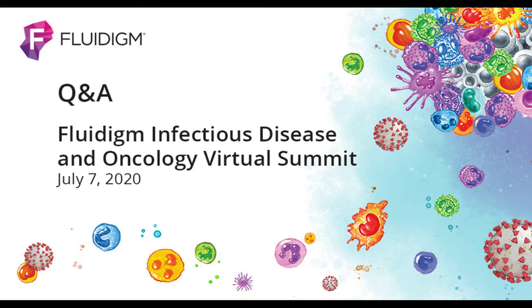And is the collection just plain saliva, or do you have to buffer in the tube? No, it's plain saliva. Neat saliva. And now, what may be in saliva that inhibits the enzyme reaction? There are a variety of different inhibitors. The EUA data that we proposed has showed it just works with neat saliva. We believe that from literature studies in our field and other fields, inhibition is not going to be a substantial issue for the workflow we've described.